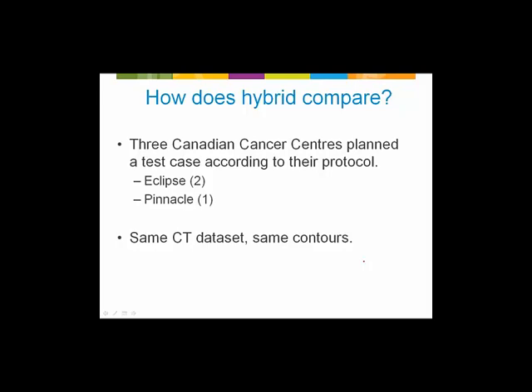Now, we were all using the same dose constraints on our targets, but it was more of the technique. How would you approach this case?